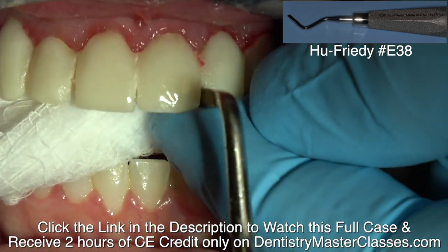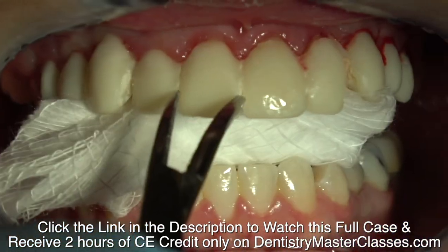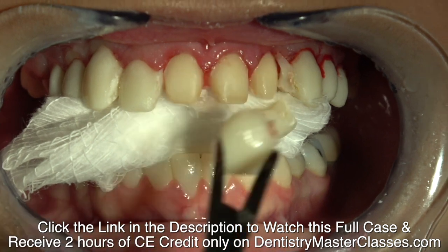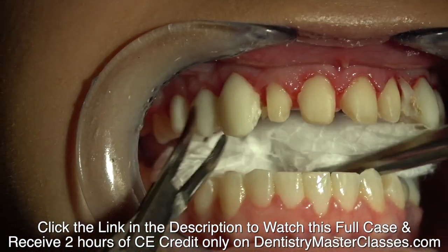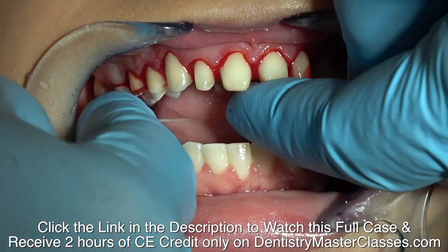Remember we seeded the provisionals with adhesive — no primer, just adhesive, Scotch Bond adhesive. I didn't etch the teeth so the adhesive will come off in the provisionals.